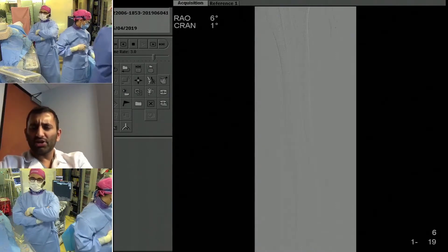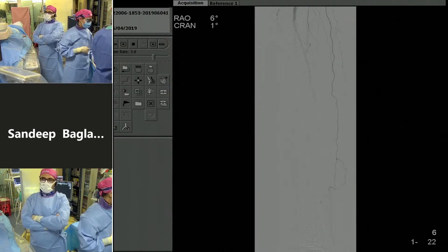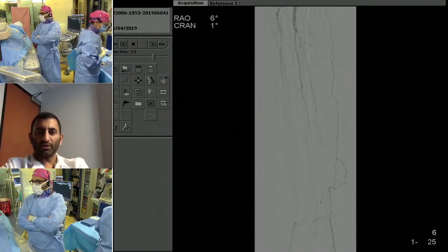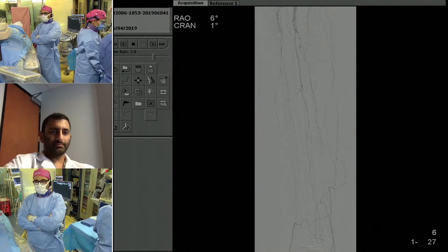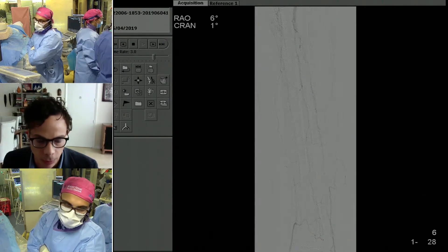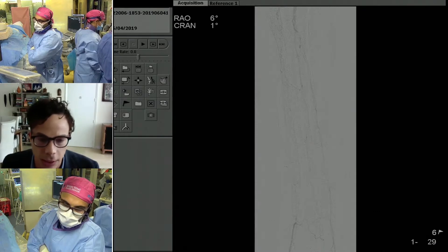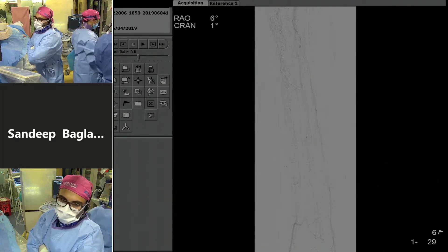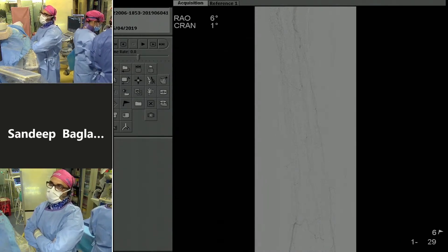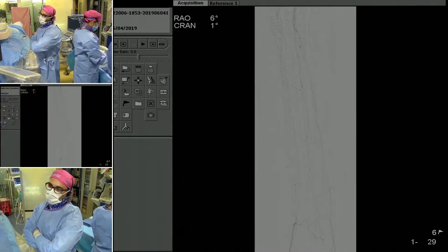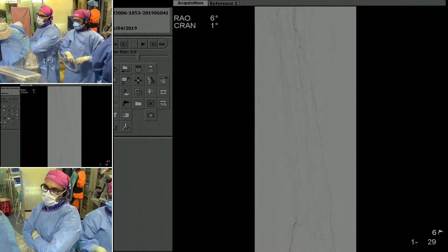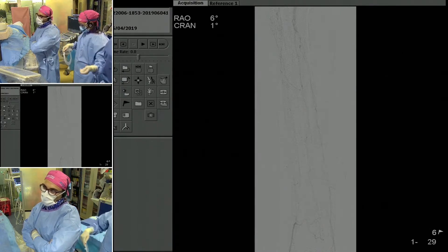Is this patient large, or is the groin suitable for antegrade? He's not a large patient — it would be suitable for antegrade. I'd favor converting to femoral; that would certainly be easier. In terms of workup beforehand when choosing whether to do a radial peripheral intervention — do you get a CTA or a diagnostic angio ahead of time? It's nice to have a CT angiogram when possible, but this gentleman has CKD so we elected not to do that. It's reasonable to do a diagnostic angiogram, determine feasibility, and treat accordingly.